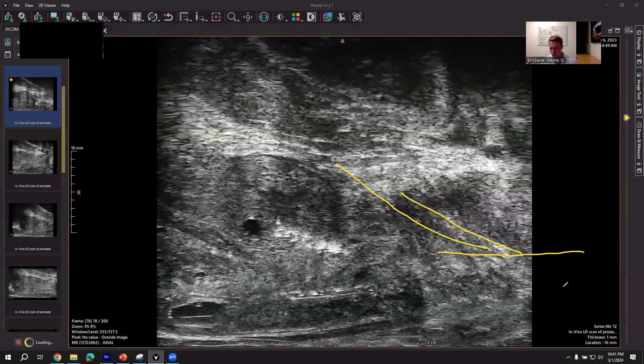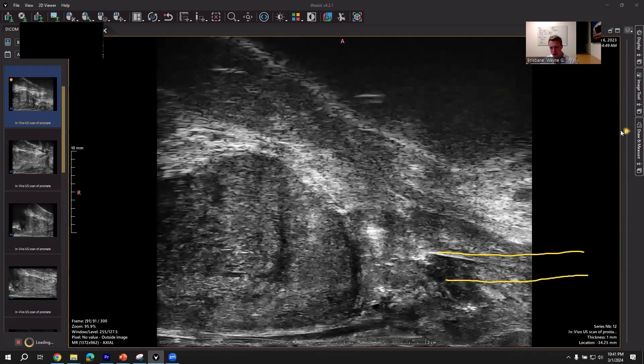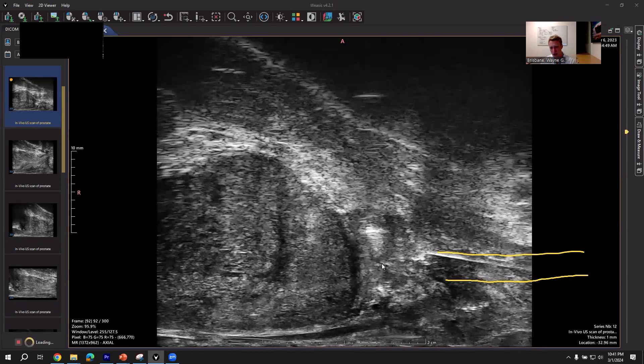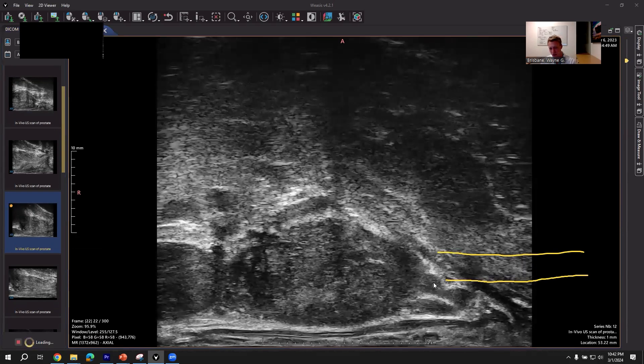You come in just lateral to the urethra but medial to the levator ani. There's this little window where you can get into the periapical triangle without having poked the levator ani — because it hurts. But you're not directly under the urethra either, so someplace right around here. If you go too far, you can start to see the levator ani coming down. You can also see there's more fluid in here. You also have to be careful not to poke into those big veins and instill them with lidocaine.